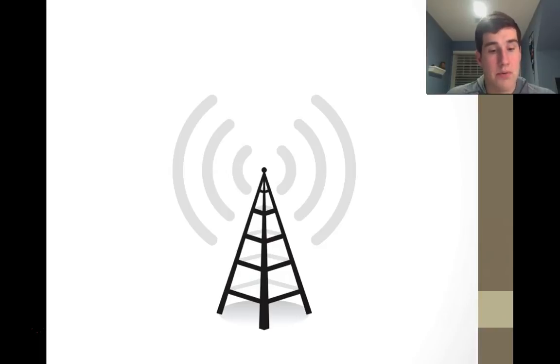The scanner also produces a radio frequency that creates a varying magnetic field, in addition to the first magnetic field that aligns the proton spins.